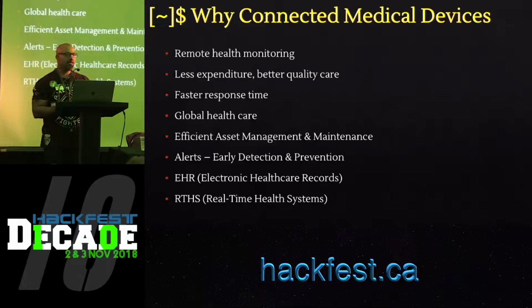If you look at some of the database content, there's patient code, there's another patient code for some reason, then there's patient first name, last name, date of birth, gender of the patient, and so on. Tons of interesting tables. I couldn't include screenshots for all these tables, but here you can see that there's a column for username, password. Obviously, password was in plain text.